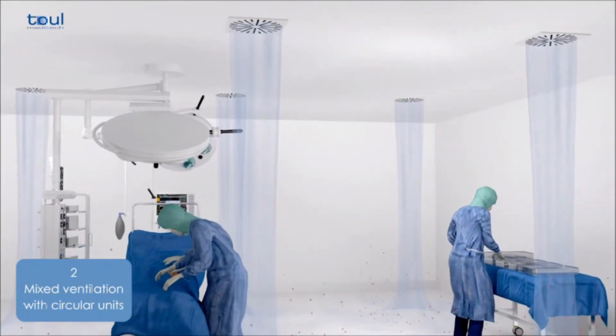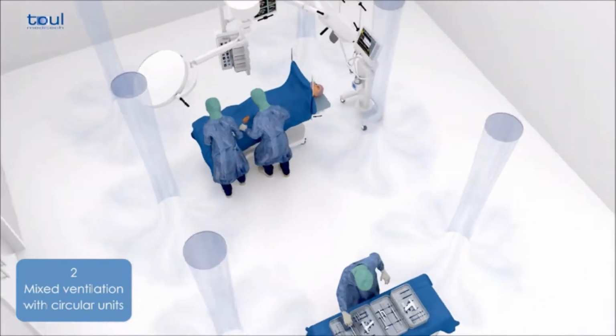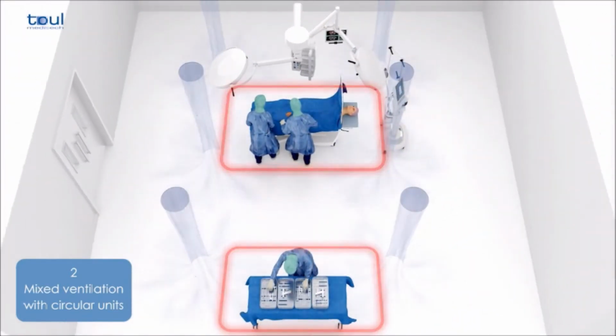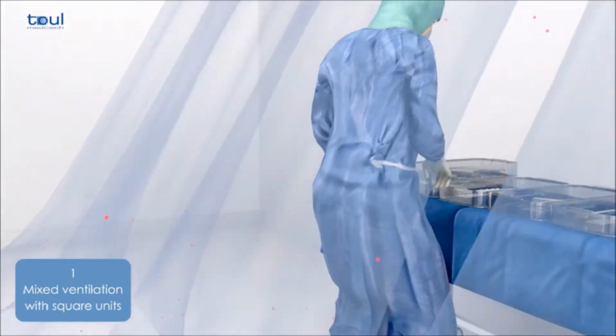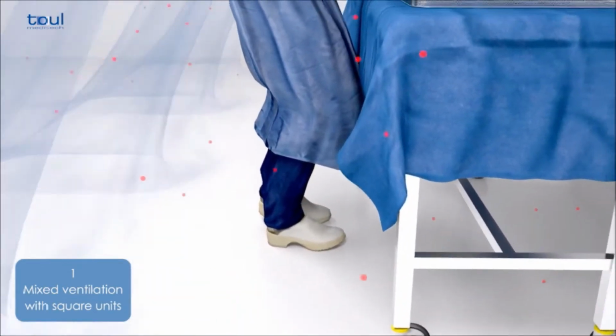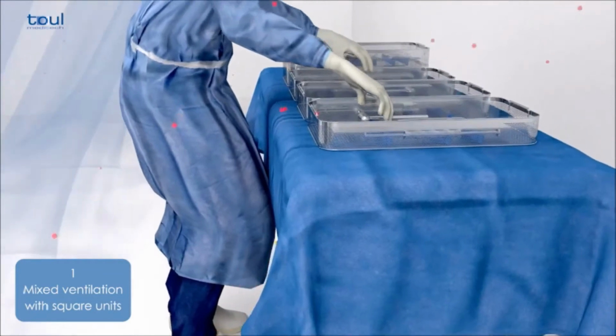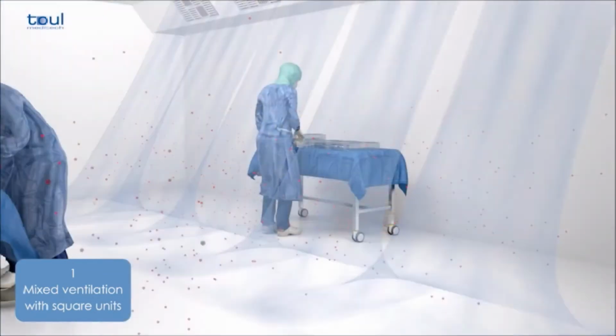Air, filtered through conventional ventilation systems, is first directed towards the floor and then distributed homogeneously throughout the operating theatre. Despite all measures to maintain asepsis, the floor of the operating theatre is always contaminated. Thus, bacteria can be transmitted to the patient through the instruments and surgical wound.